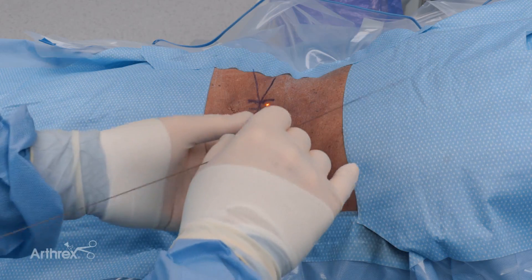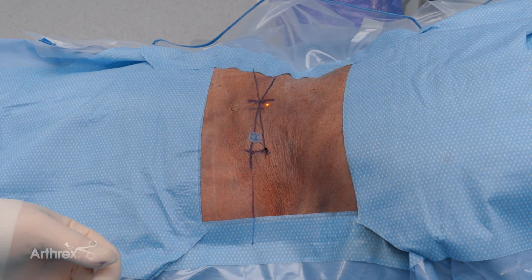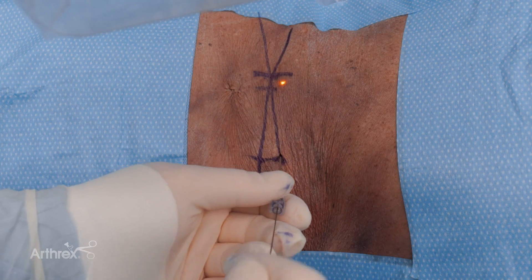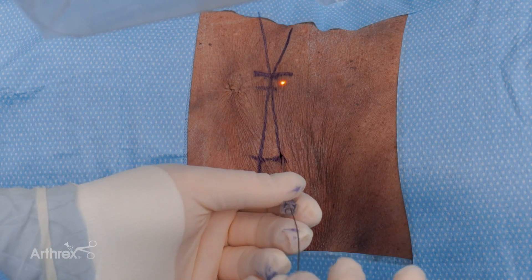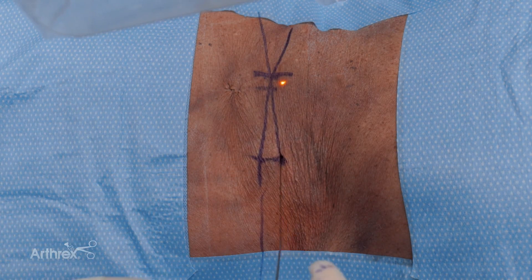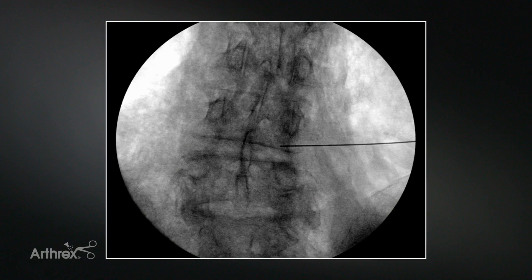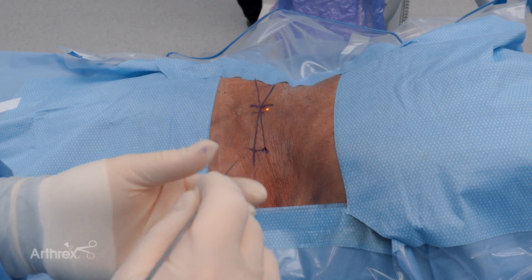Now that the needle is in the right place, we take out our stylet, insert our guide wire, and maintain the guide wire while we remove the needle. Now that we've confirmed the guide wire is in the right location, we'll dilate over the guide wire.